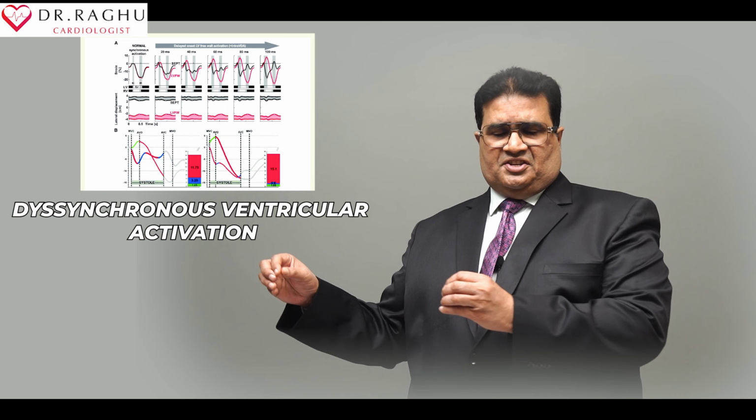Patients with heart failure with low ejection fraction, less than 40%, have very good medicines to treat the heart failure. But there is a group of people who have an electrical conduction system problem that is leading to the low ejection fraction. That is, there is a muscular system as well as an electrical system in the heart. If the electrical system is leading to a weak muscle, then the treatment has to be targeted towards the electrical system of the heart.